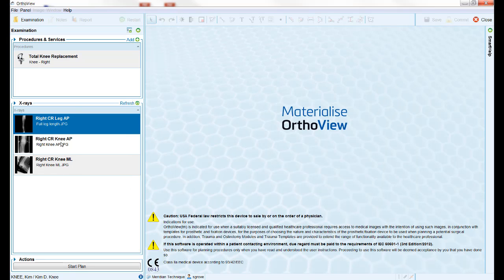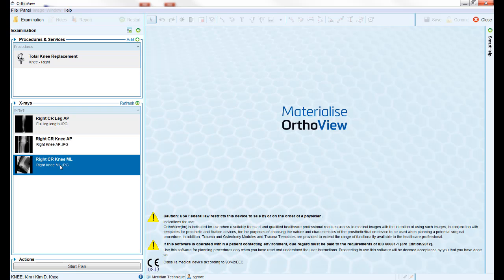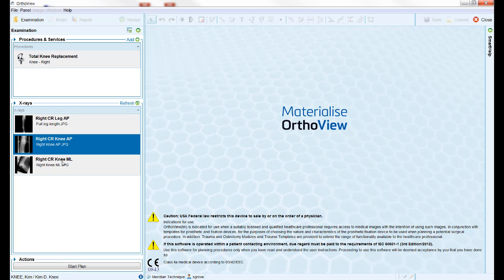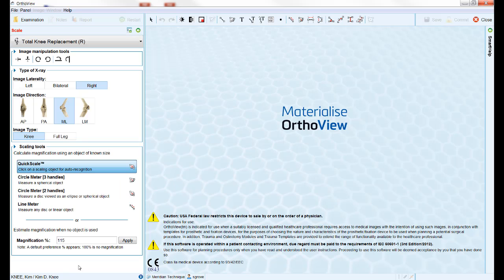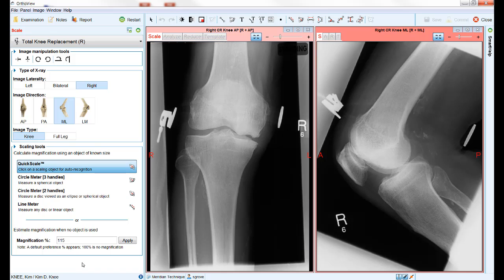On the left of the screen, select the required images from the study list using the control key to select multiple images. Once the procedure is added, the software will then move on to the next step.